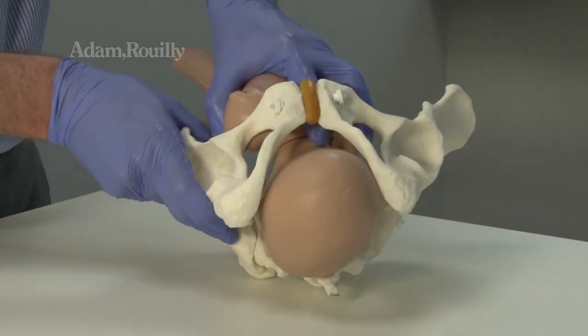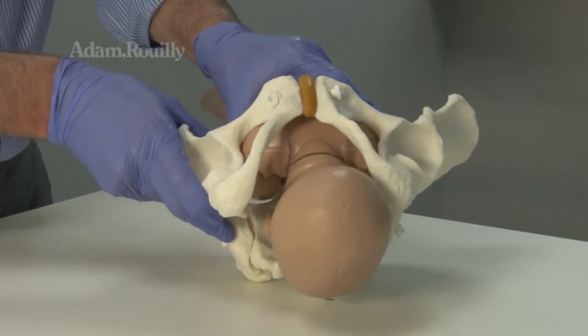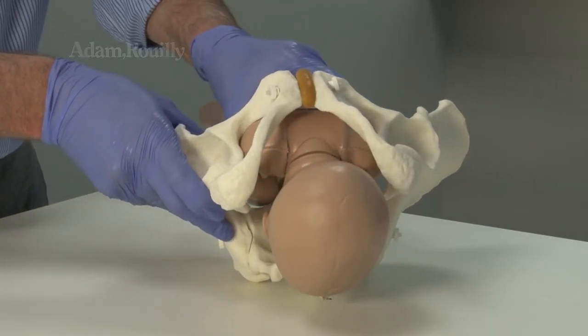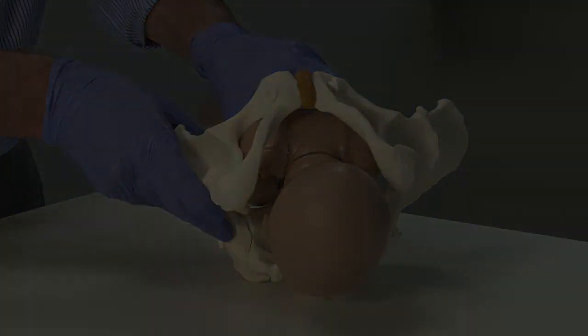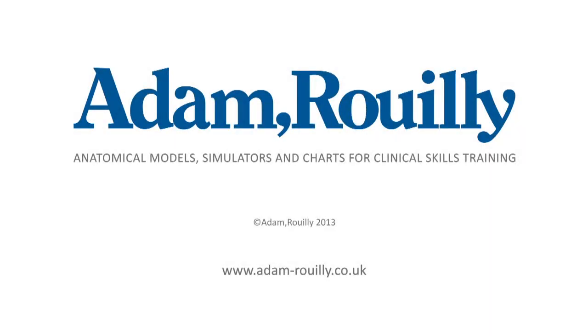The AR35 plastic pelvis is a useful demonstration aid.